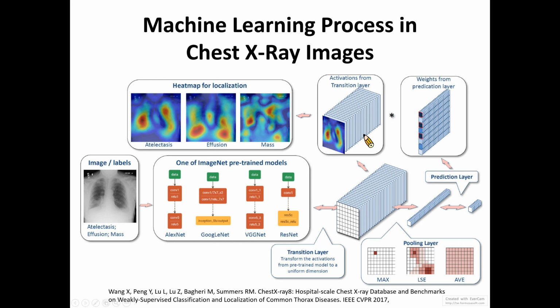So there are several convolution and max pooling layers, but at the end of this neural network model, it's always connected to the fully connected layer, the softmax layer, and the classification output layer. So these three are the important layers that determine the output of your neural network.